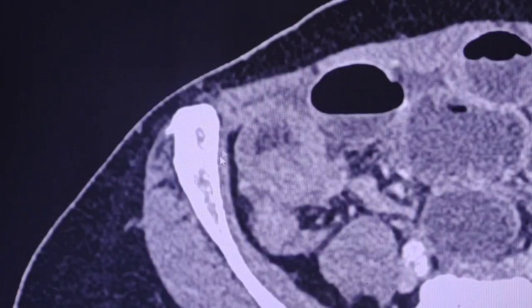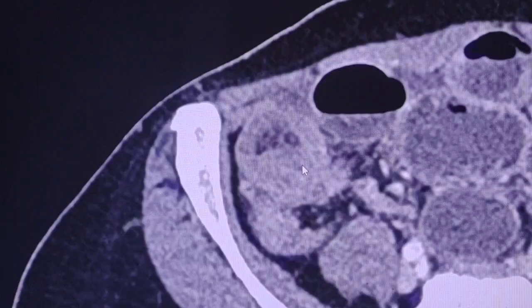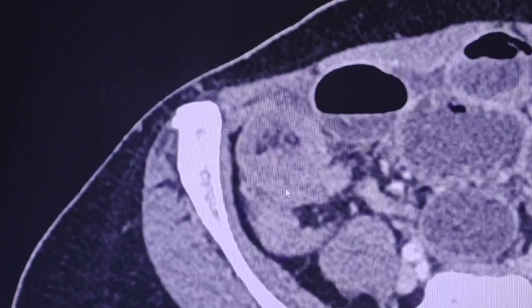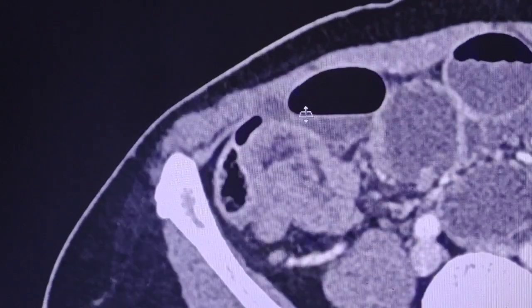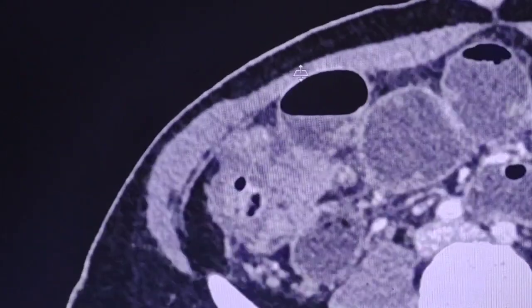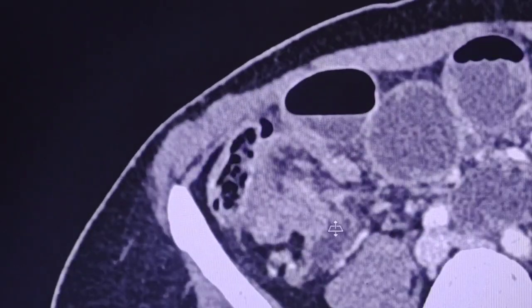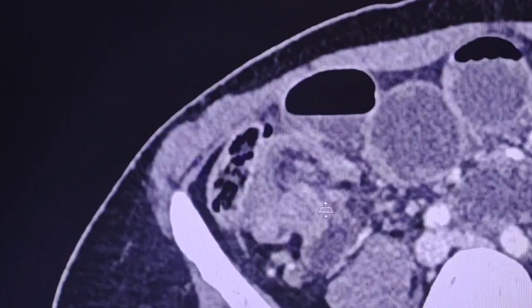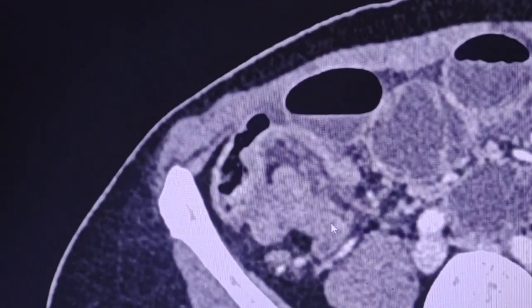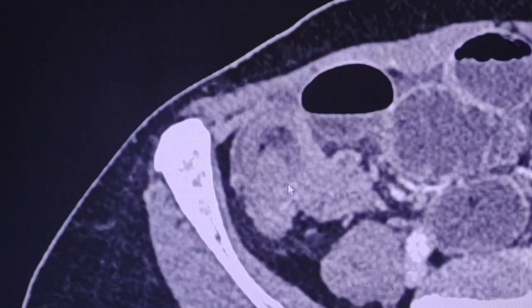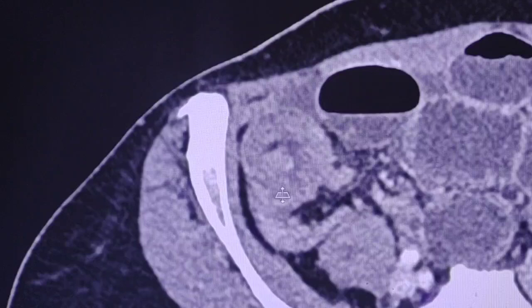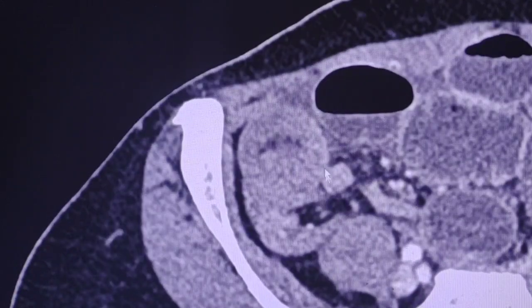Pay attention at this region. As you can see, it is like the small bowel is inserted into itself — and this is the intussusception. Bowel within bowel.